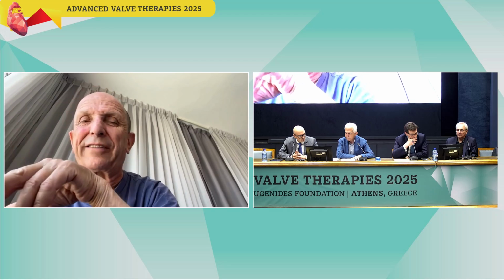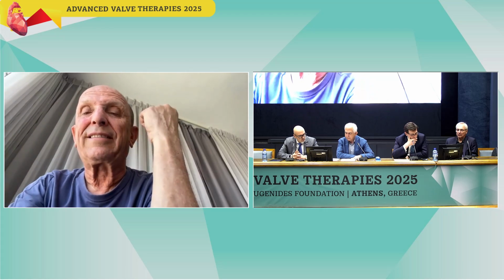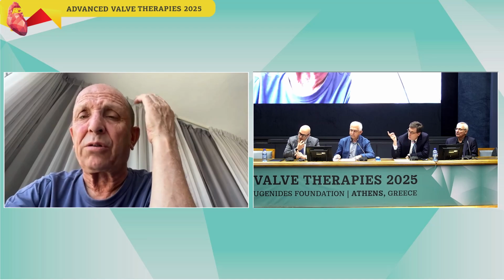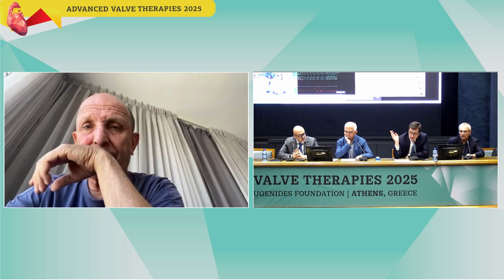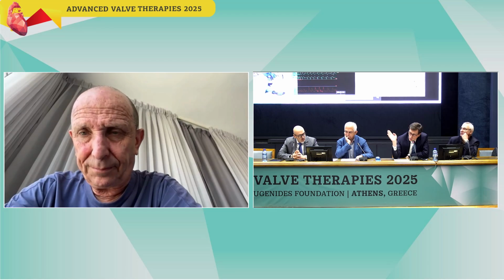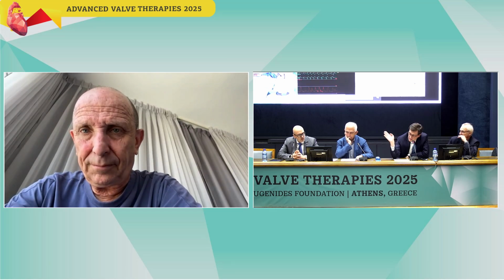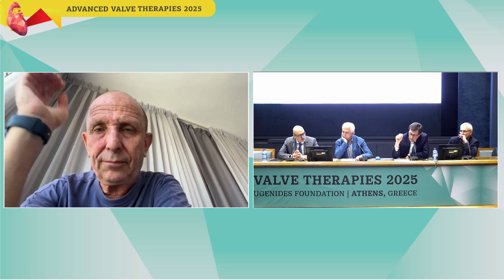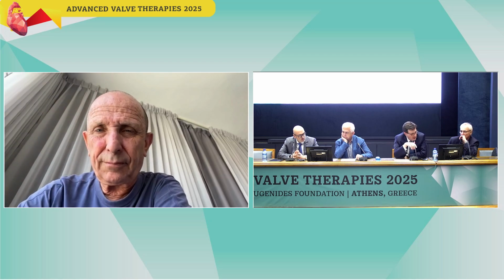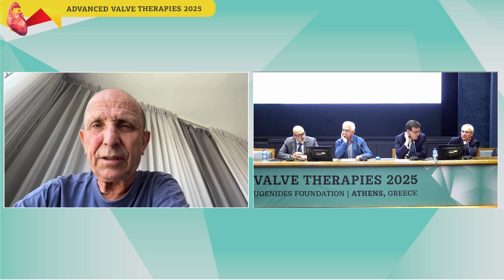I'm sorry, but according to the program that I have, I was supposed to join you only about 5 minutes ago, so I didn't see the measurements. Go back to the slides, AV control, and stop the video now. Go back to your slide that included the measurements, the valve, and the table with the different valve possibilities.